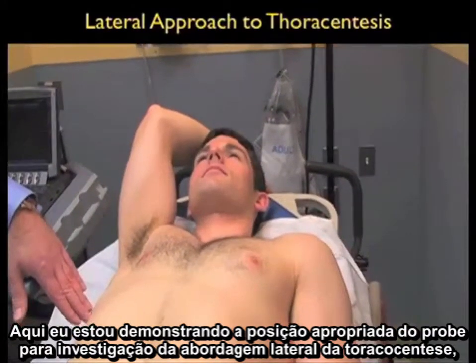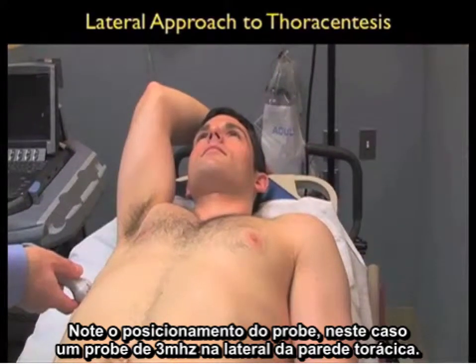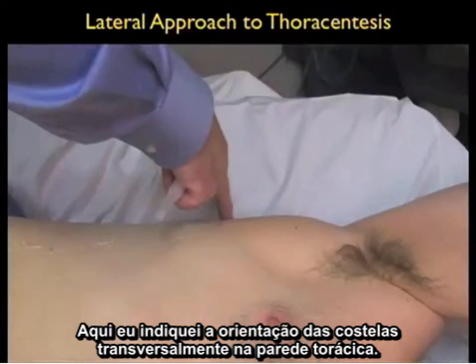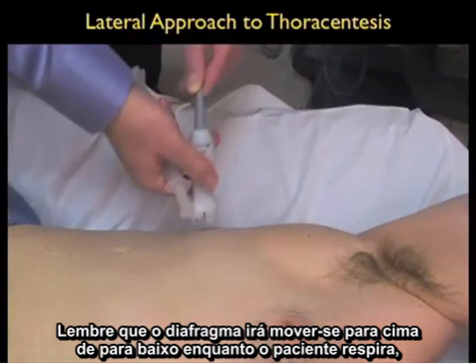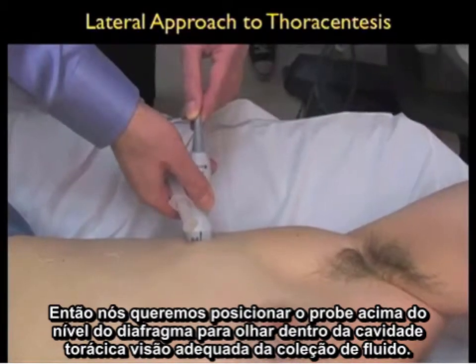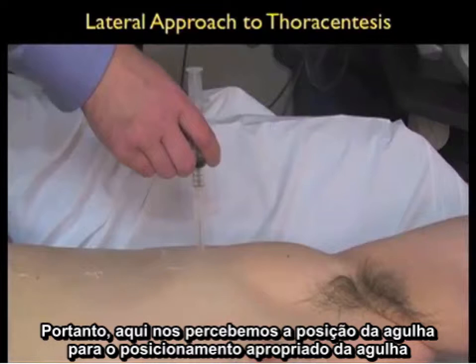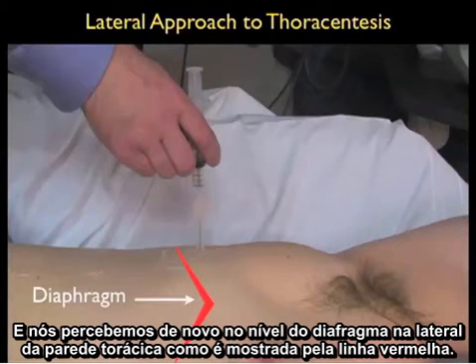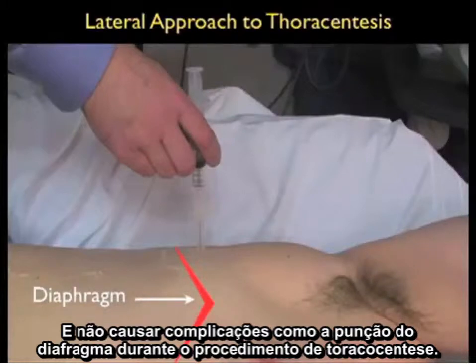Here I'm demonstrating the appropriate probe position to investigate for the lateral approach to thoracentesis, this time on the right chest, using the three megahertz probe on the lateral chest wall, right above the level of the diaphragm to look for a pleural effusion. I'll indicate the orientation of the ribs across the lateral chest wall and the orientation of the diaphragm. Remember the diaphragm moves up and down as the patient breathes, so we want to place the probe above the diaphragm to look into the thoracic cavity. The needle must be positioned above the diaphragm on the lateral chest wall so it can safely enter the thoracic cavity and avoid complications such as puncture of the diaphragm.